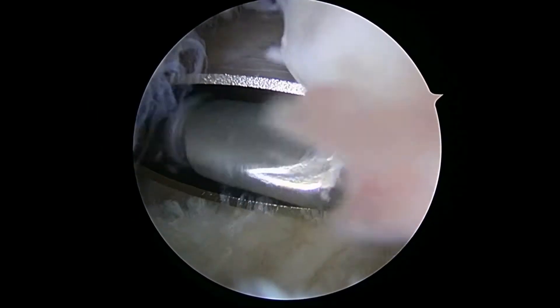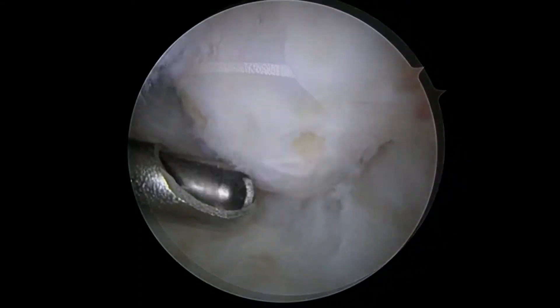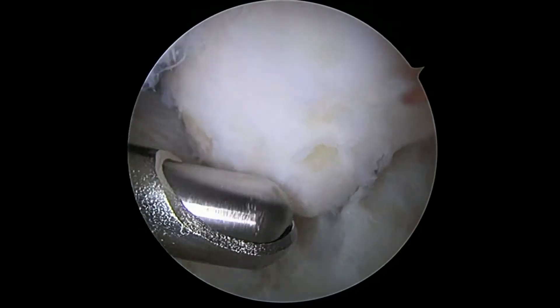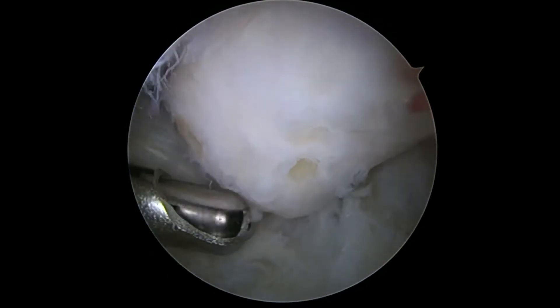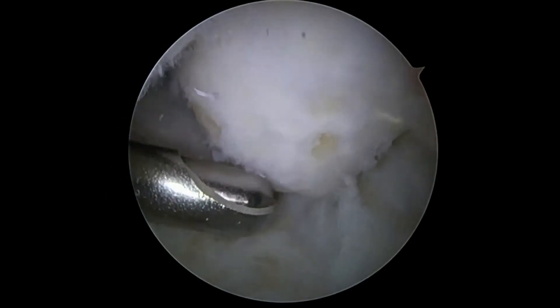All right, Stephen, I'm trying to burr this down. It might take a little while. I'll show you what it looks like hopefully once we get it small enough to take out or completely chewed up. We're still working on this — this is pretty much what's taken all the time. You can see now it's kind of loose. You can see how huge it is — it's just huge. It's like you've got a golf ball in here. We're going to keep working until we get it out.